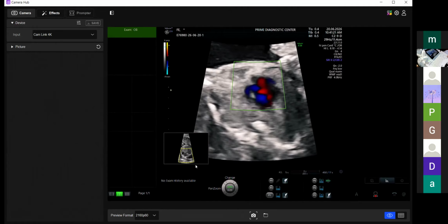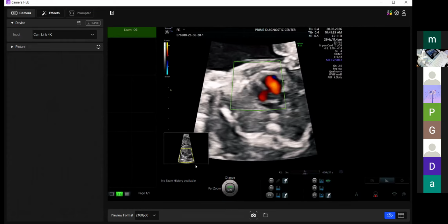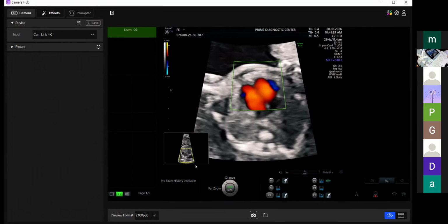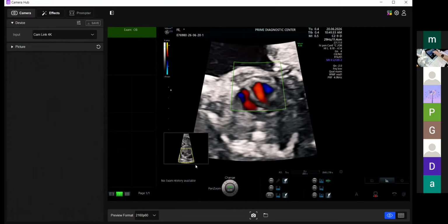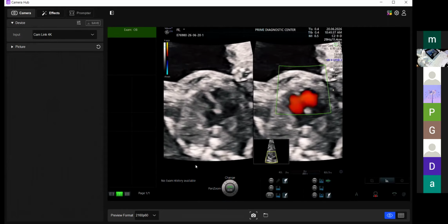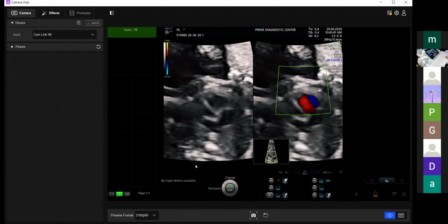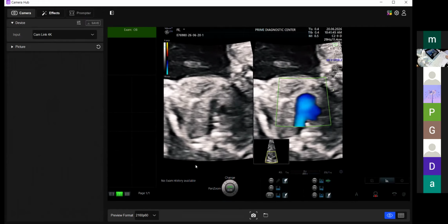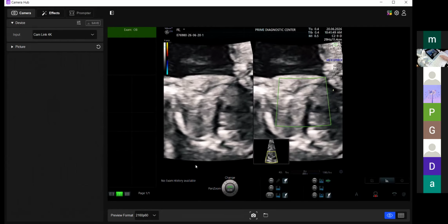So what I do is I go cranially and I rotate the probe clockwise. I'm going cranially. I see an aorta in a bigger length. I would do it side by side. Now you see the aorta, one-third of the ascending aorta. That is by clockwise. In the same position, I'm moving more cranially, and I get the RVOT view.